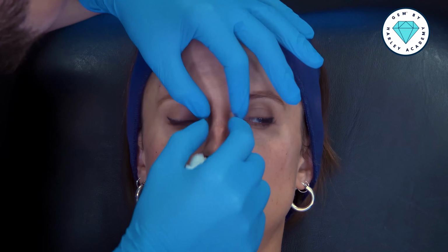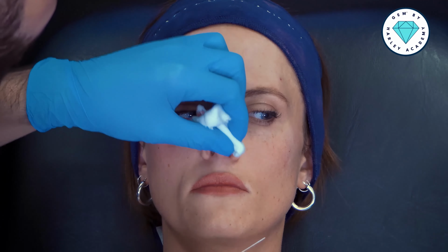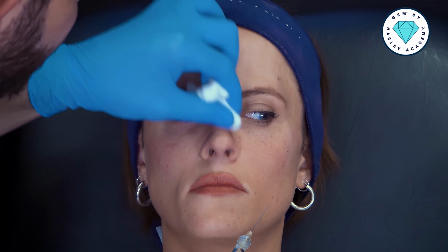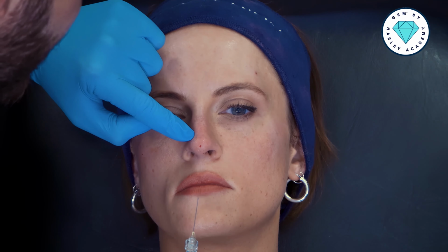From the side, actually, I have seen that the nose is significantly straighter already. And so I'm going to use the next stage of the treatment to just address where I see little interruptions in the definition of the nose. And I see that mostly at the lower third.